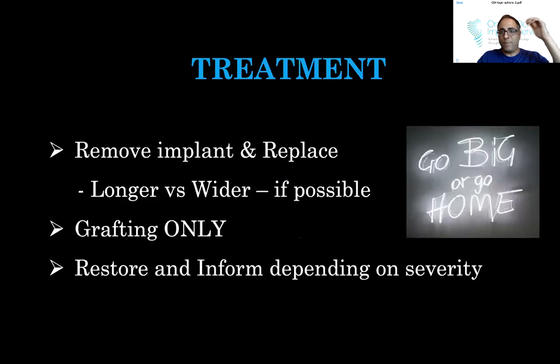So how do we treat a bad position? Go bigger, go wider: remove the implant and replace it if it's not in the right position. So go longer, go wider. And most of these problems result from, as I mentioned, not really looking at your guide pin x-rays, okay?